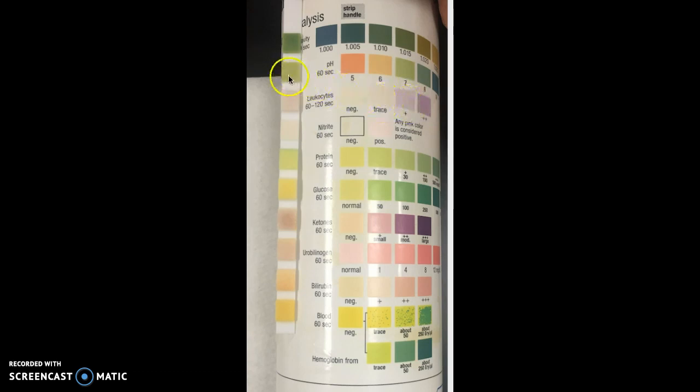You can measure the pH here. You'd have to slide it all the way over there. It looks like it matches up to 7. And then the specific gravity can also be measured with this strip, and it looks like it's somewhere around 1.015. That's how you do it.